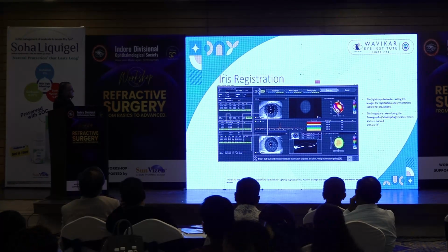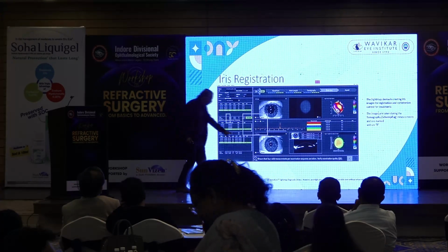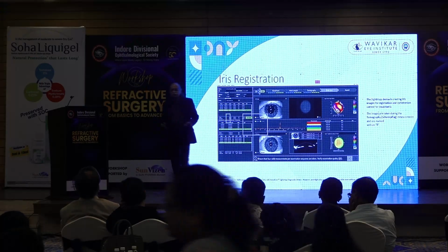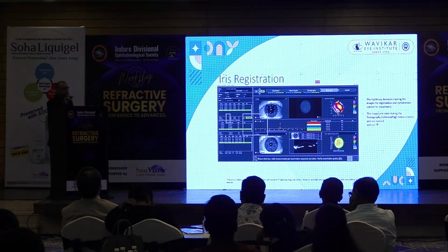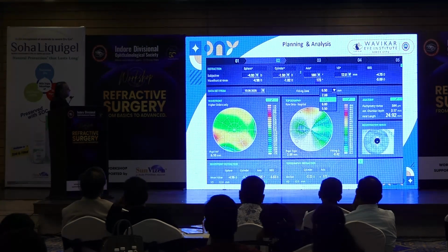And this is a registration window. So here R comes here, which means that these things are good enough for registration. Without registration, there is no point in going ahead with Wavelight Plus treatment, because you will not be compensating for cyclotorsion. Now this is a live example.